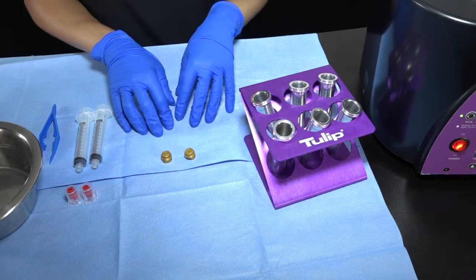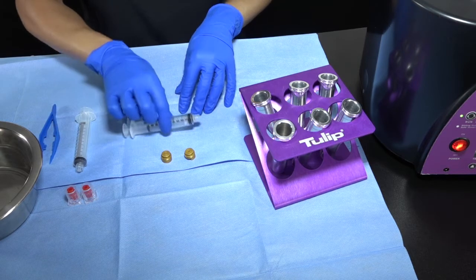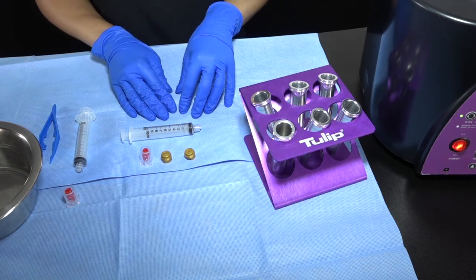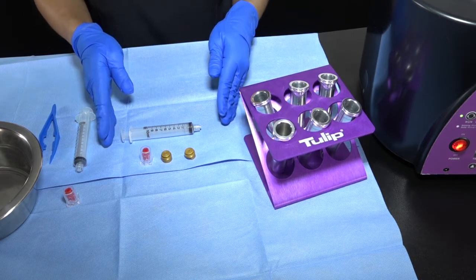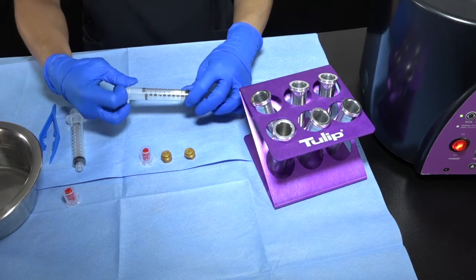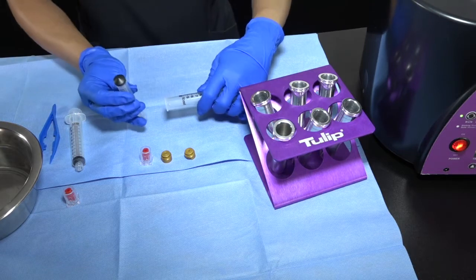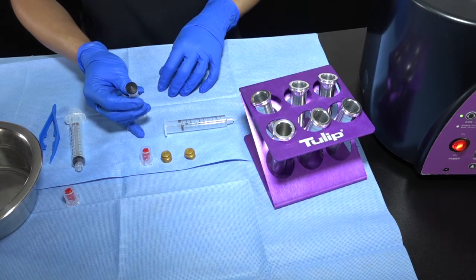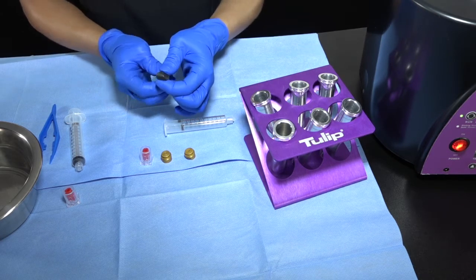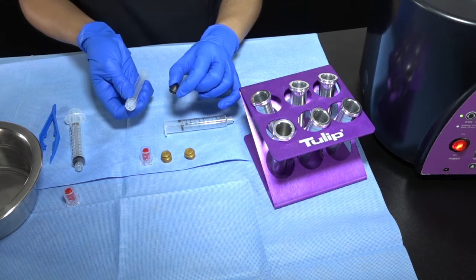You need to prep your crown before centrifugation. To do that, you need your crown, a 10cc BD syringe, and a red cap — all should be sterile; this is a sterile field. To put the crown into the BD syringe, it has to be a 10cc BD syringe. Take the plunger out on your sterile field and remove the rubber stopper. Simply pinch and lift with the thumb — this is the easiest way to do it, though it's not easy when you have gloves.